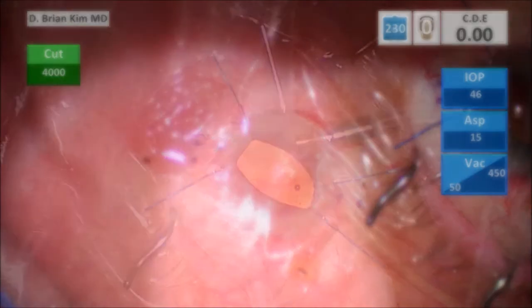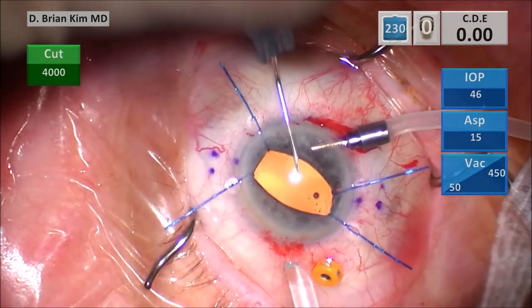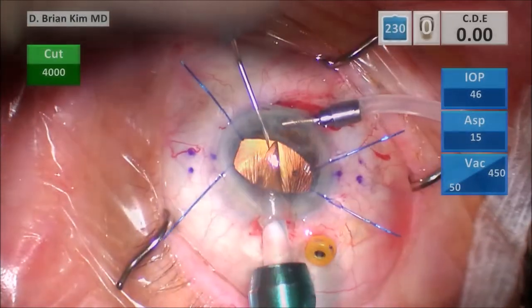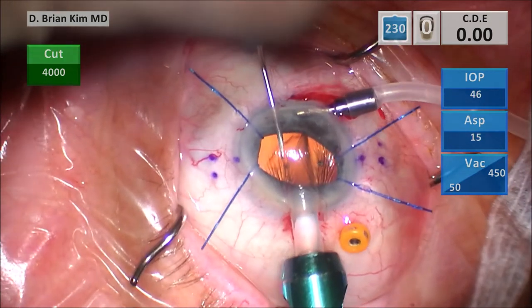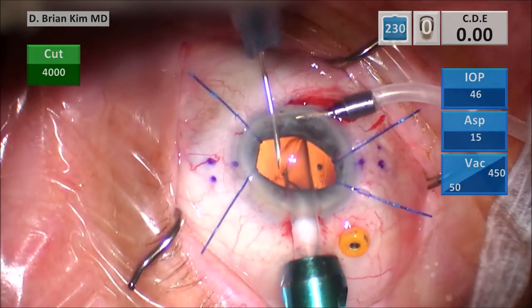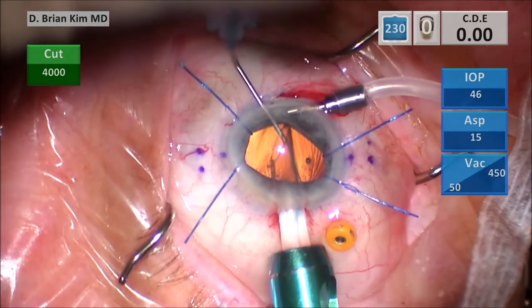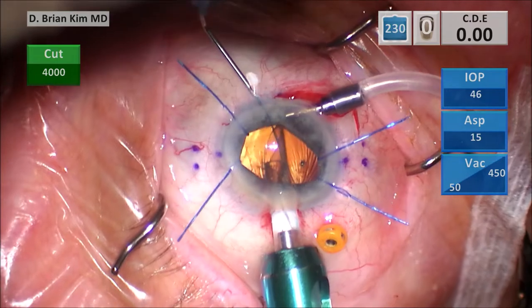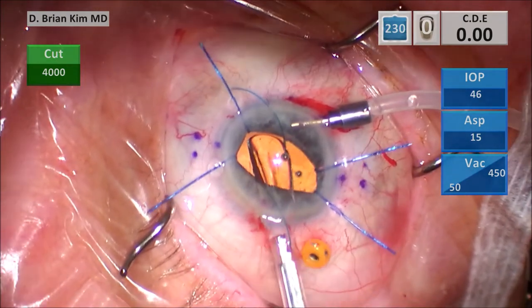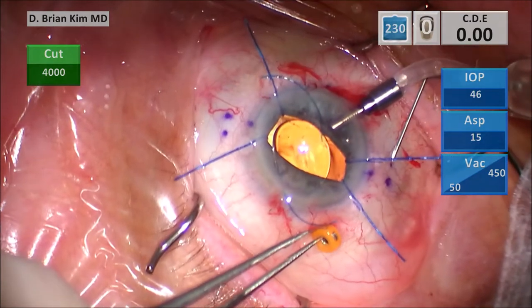Go ahead and place the 25-gauge needle through the contralateral incision, then place the cartridge through the main incision. My assistant is supposed to help me — I want her to always have BSS on hand, because you need BSS in order to visualize what you're doing given some corneal folds and striae. Since she's pushing the plunger forward and doesn't have access to the table, I asked her to grab the BSS cannula. She put BSS on the cornea, the view is nice, and she helped advance the lens. Once I was able to externalize the leading trailing haptic, I took over and swept the trailing haptic to the right, injecting some viscoelastic to coat the corneal endothelium.